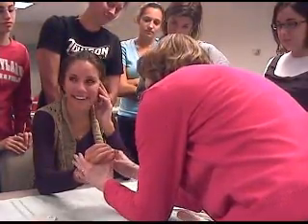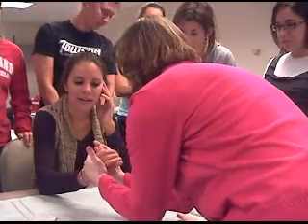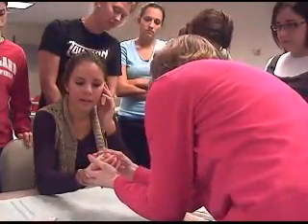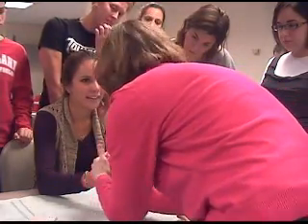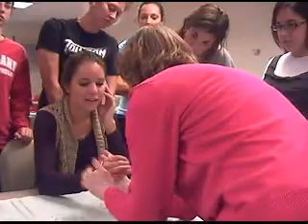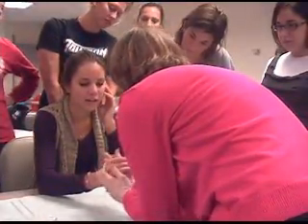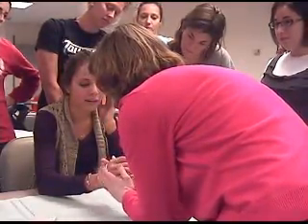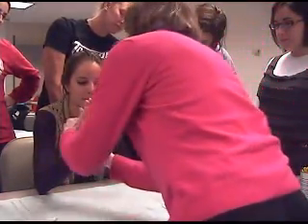Are you trying to mold them together? Yeah. I want it to overlap so that it doesn't pinch. And there's that one. So it's up to the IP. It came a little bit too high in the back, so I just kind of rolled it down. Yeah, good point. Before it's set up completely, make sure they can. Because if somebody's got a large IP, and a lot of people with arthritis do, they're in trouble. Then you're using your bandage scissors and you're hacking the thing off of them. Okay, wave at me a little bit. Let's get this, extend your wrist up.